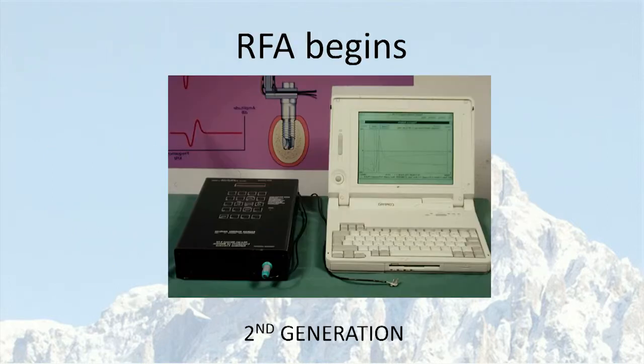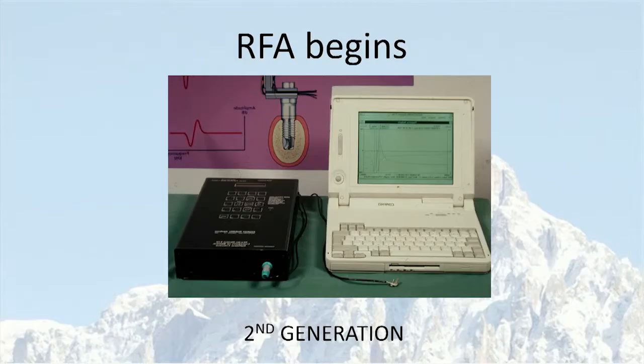But the aim was also to develop the technique into a commercially available technique. So in 1999, the first company was founded, that was Integration Diagnostics. And the inventors were the owners together with other industrial partners. During this European grant project, the technique was developed, and now we could make use of developments within mobile phone technology. So instead of using the oscilloscope and frequency response analyzer, we could now make this black box, which made things much easier. But still, we needed a computer then to read the measurements and make them into graphs.